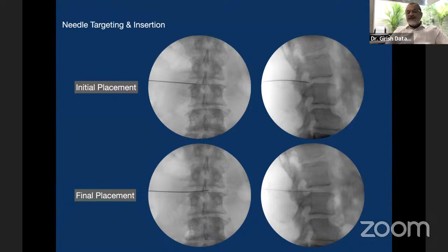So I get inside the disc. Primarily, the needle is advanced till the midline, and on the lateral, I should be in the posterior 10-15% of the disc, because this is a grade 3 herniation. That means the herniation dorsally has migrated beyond the facet joint. So I would use complete epidural or just subannular. This is my intention here.